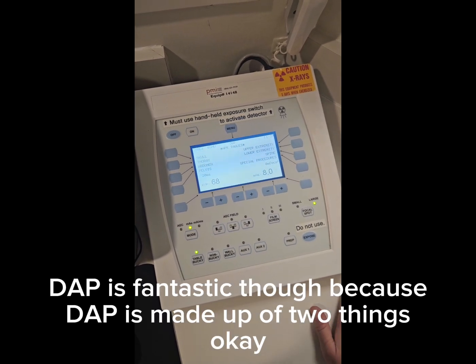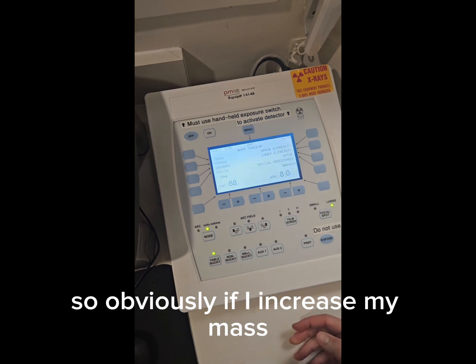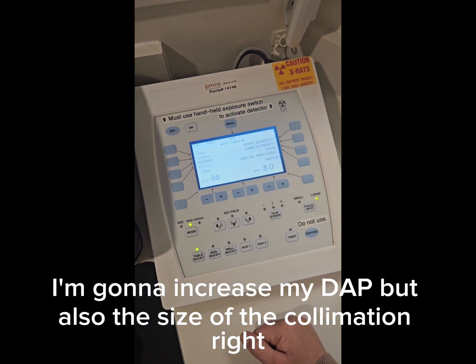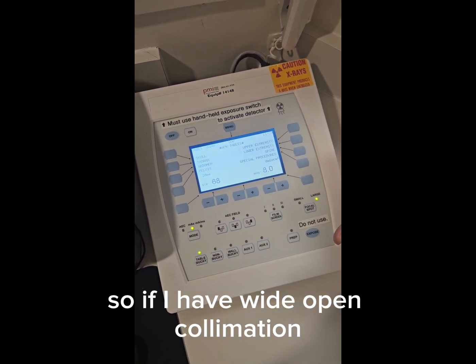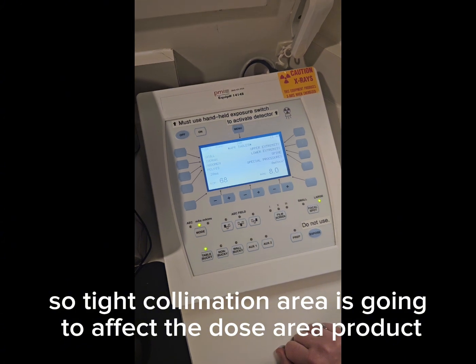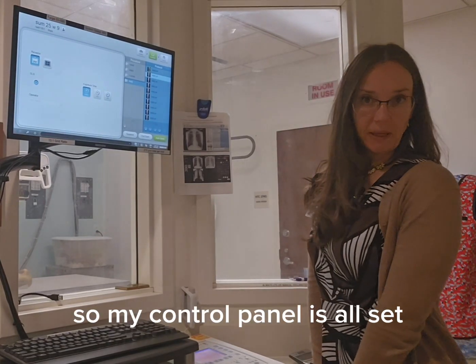DAP is fantastic though, because DAP is made up of two things, okay? One is your dose. This is my dose, 68 at 8. So obviously if I increase my mAs, I'm going to probably increase my DAP. Increase my kVp, I'm going to increase my DAP, but also the size of the collimation, right? So if I have wide open collimation, I'm going to receive more radiation than if I have a tight collimation. So tight collimation area is going to affect the dose area product, as well as the technique is also going to affect that. So my control panel is all set.